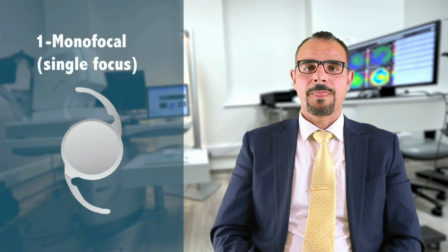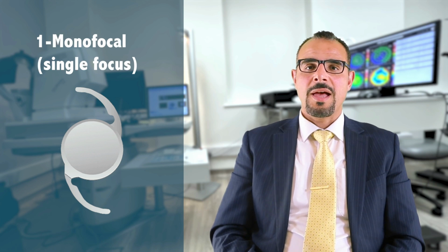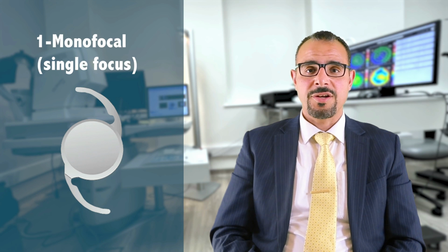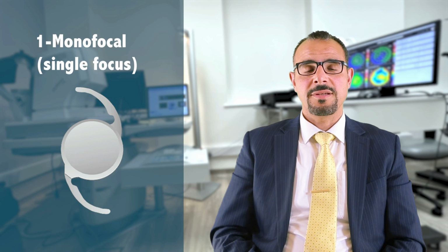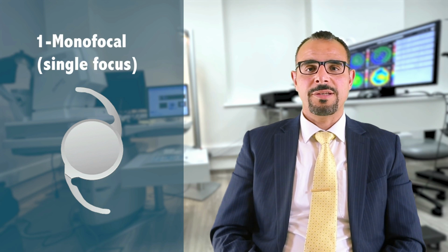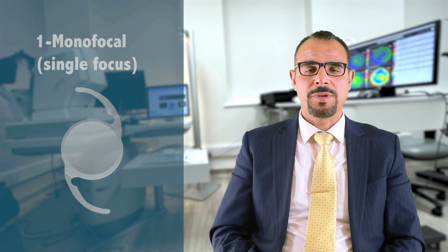Monofocal lenses. These lenses have a single focus and they are the standard care after cataract surgery. They aim to correct the vision after surgery for distance, which means that you will need reading glasses after the surgery, like most senior people.